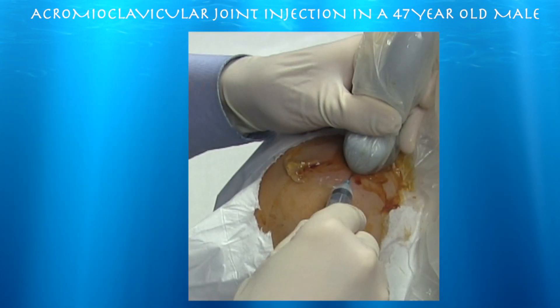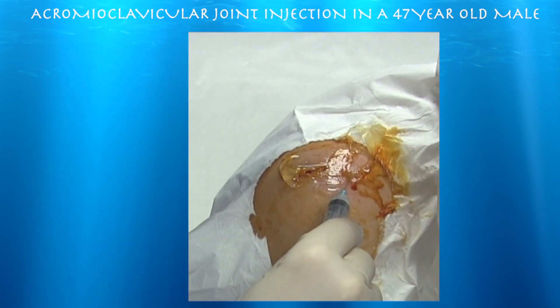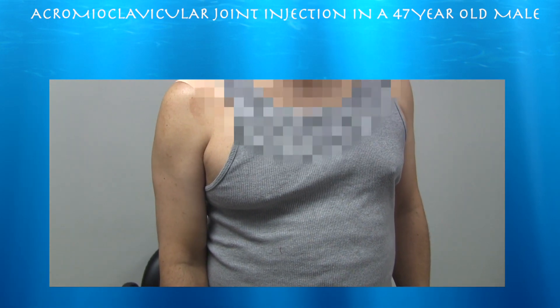Here's a close-up of this in-plane approach of the acromioclavicular joint injection. This is after the injection. We didn't use any lidocaine because it does have some chondral toxicity. I'd rather not use it if I don't have to, but maybe for him it would have been good diagnostically.